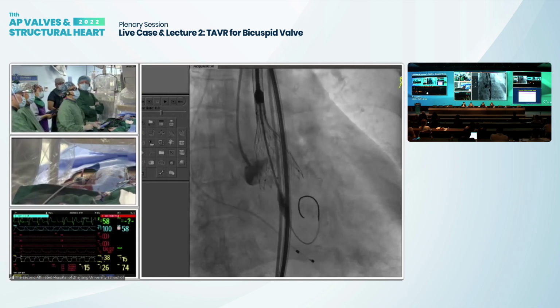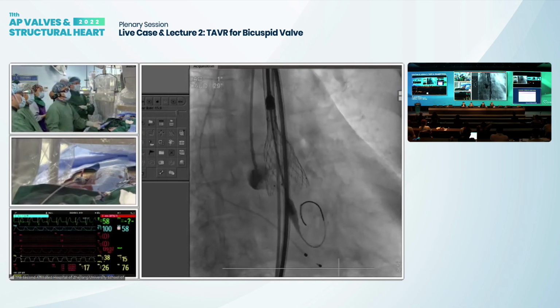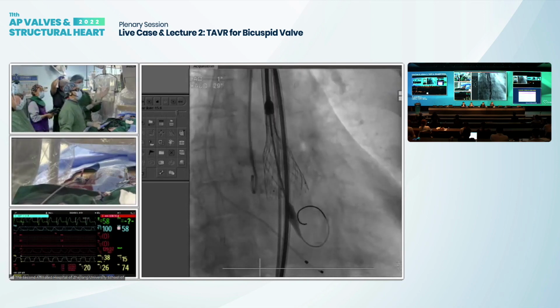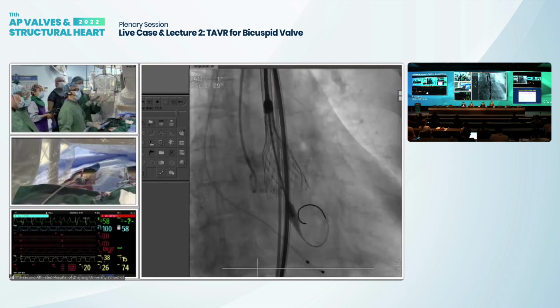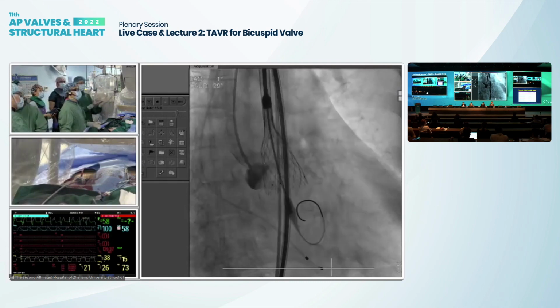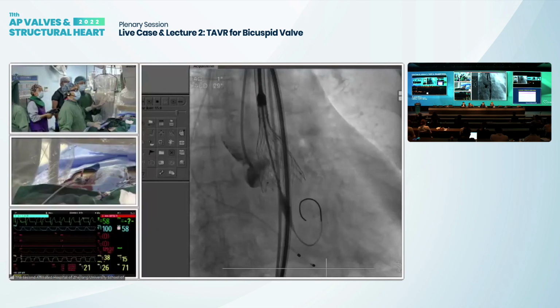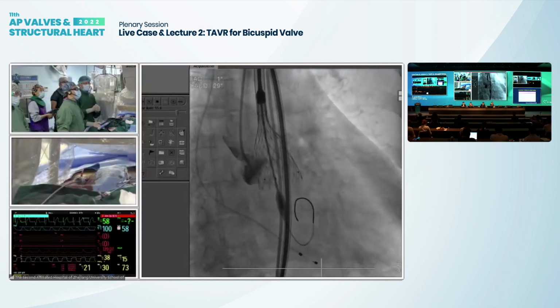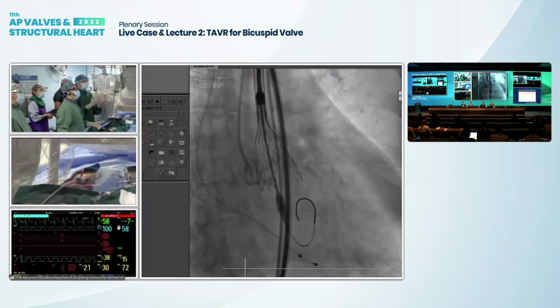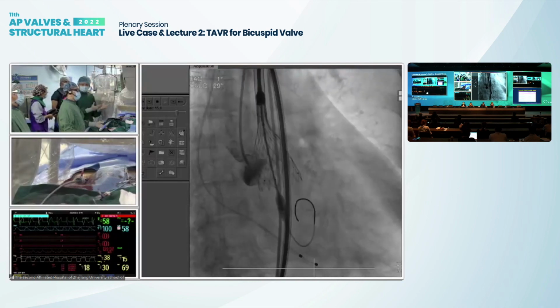It's okay. I think it's okay. It is not much better because we will have a second adjustment of the position. So regularly, the spontaneous adjustment is good for sealing the annulus. In most cases, after spontaneous adjustment, the leaking will be decreased significantly.